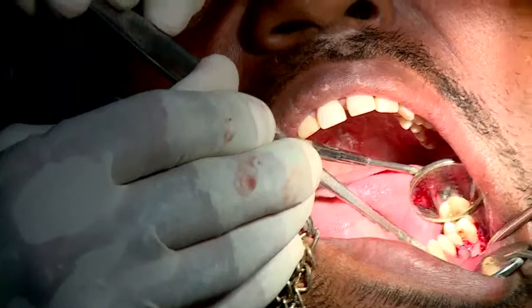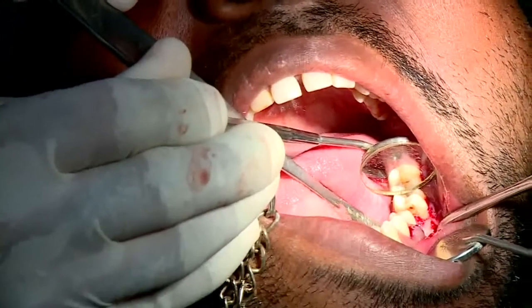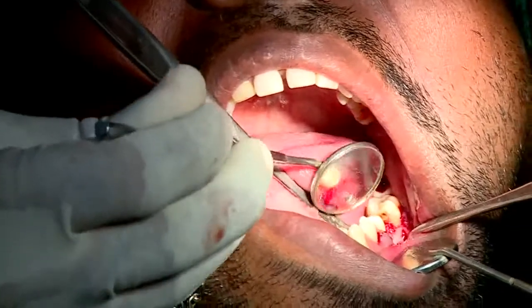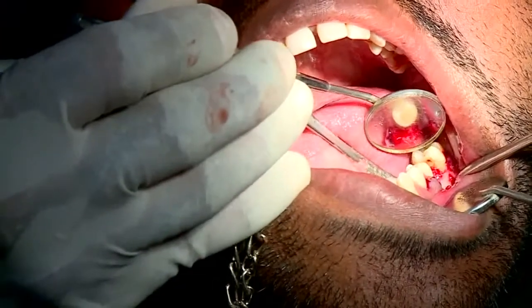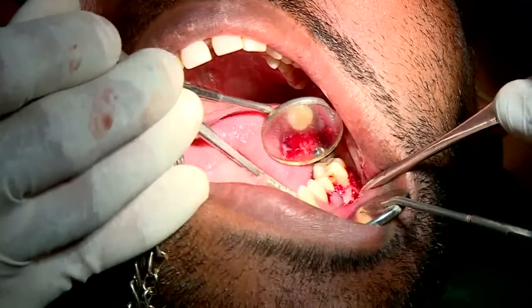Okay. Now I have driven that 1.5 millimeter again. In fact, on the lingual side, if you can see, it has become really flush. On the buccal side, maybe just half a thread is missing, but honestly, if I go any deeper than that, bone will overgrow my implant when I am placing my abutment. So I think I am going to stop here.